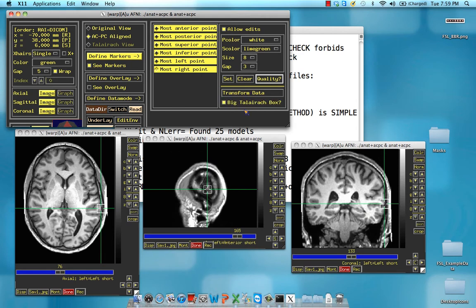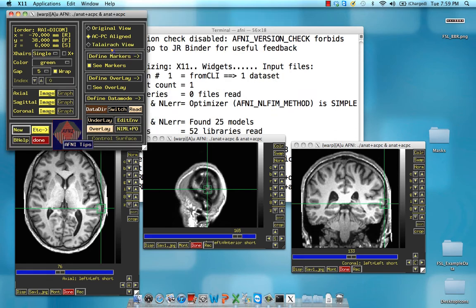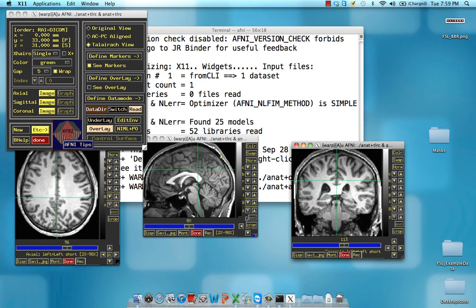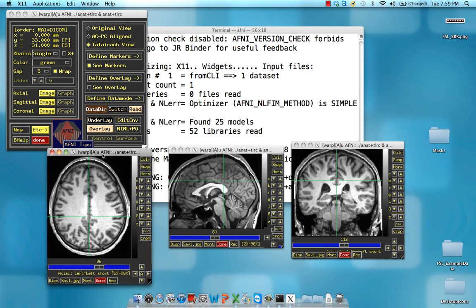Click on Transform Data. Leave the big Talairach box checked — that's a legacy option from the old days; just leave it alone or bad things will happen. Click Transform Data, and now you see the Talairach view becomes unlocked, no longer grayed out. Click on that, and now we are in Talairach space. The ACPC have been aligned, and we are now in a bounded box with the same dimensions as a Talairach-Tourneau atlas.